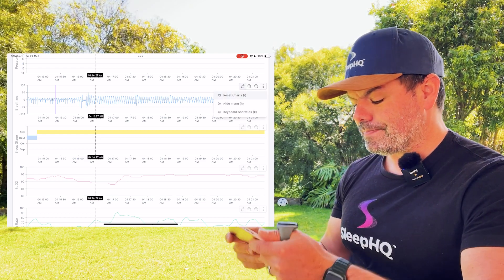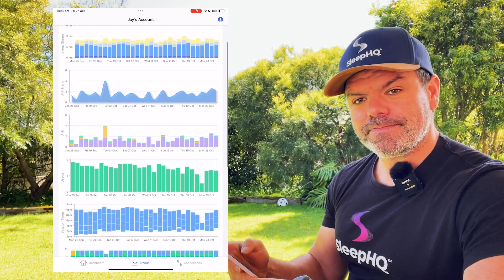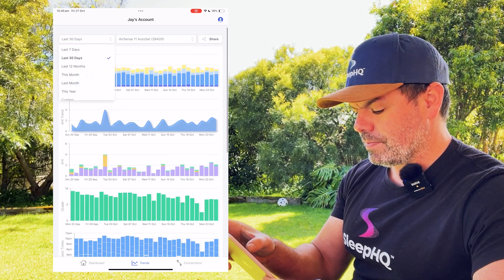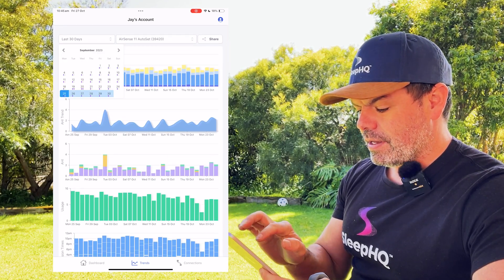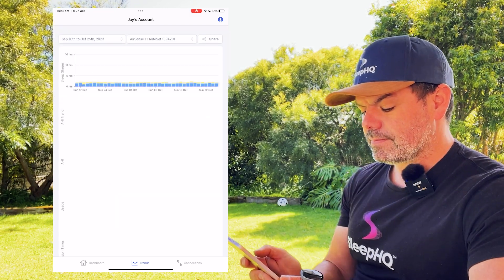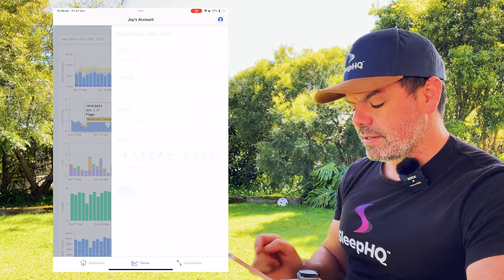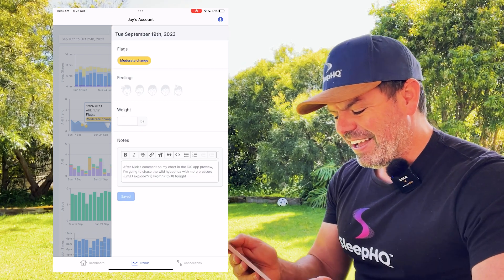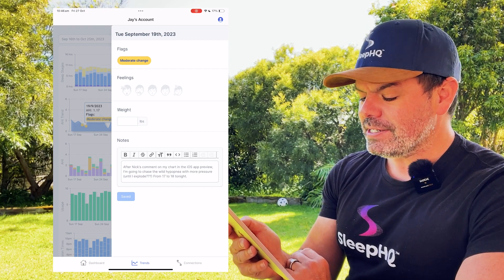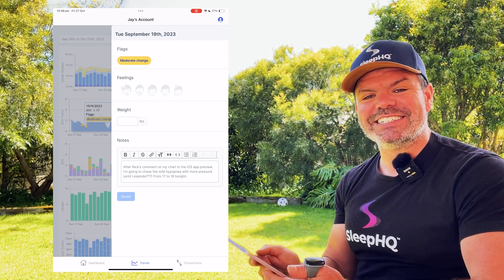Let's check out the trends. Here's the trend page — beautiful, looking nice. We'll just go to custom and go from the 16th September to the 25th. Now you can see on the AHI trace there's two yellow dots. Have a look at this — after Nick's comment on my chart in the iOS app preview, Jay wrote: 'I'm going to chase the wild hypopnea with more pressure until I explode, from 17 to 18 tonight.'